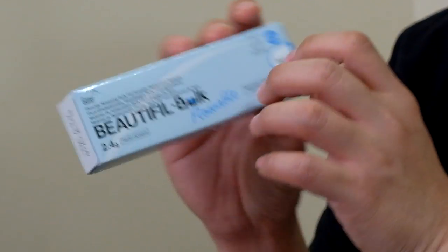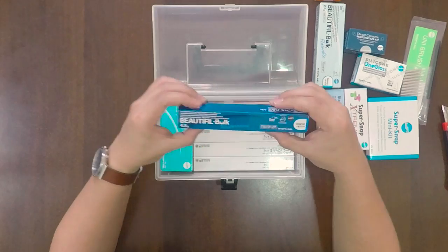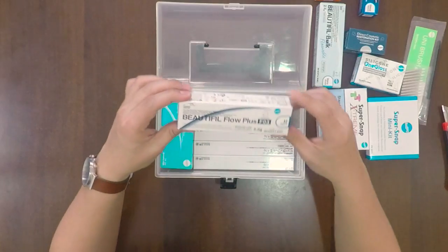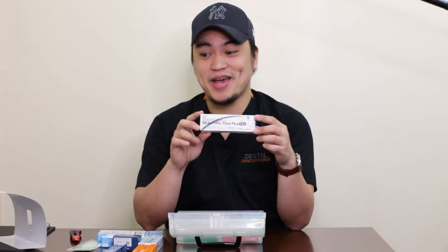Beautiful Bulk. The Flowable. Beautiful Injectable. Beautiful Bulk as well — it's a fluoride-releasing bulk restorative material. And Beautiful Flow Plus. This box is jam-packed with things. I don't even know how to put this back in later on. I'm pretty sure I can't put it back in.